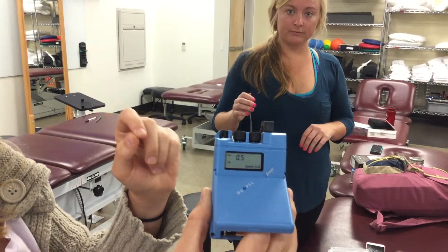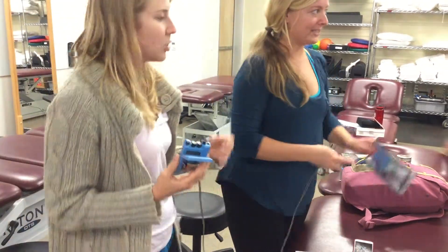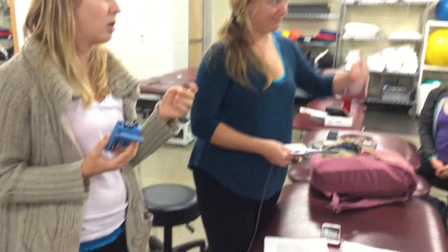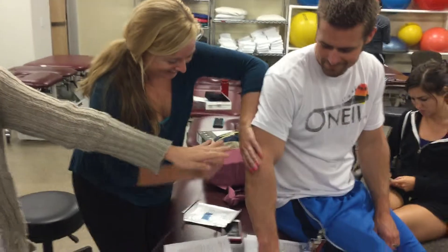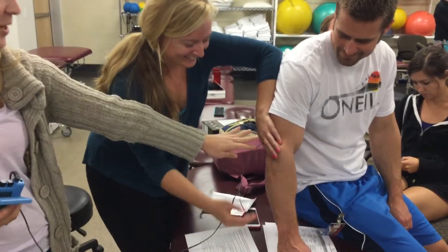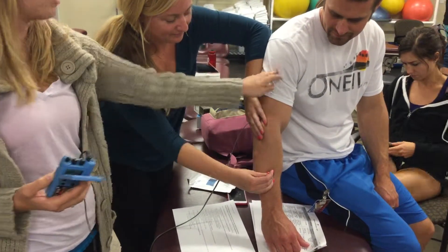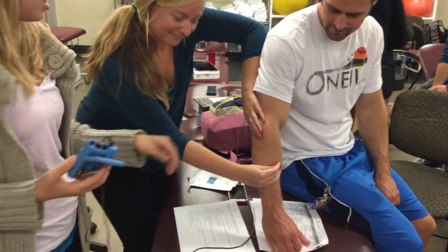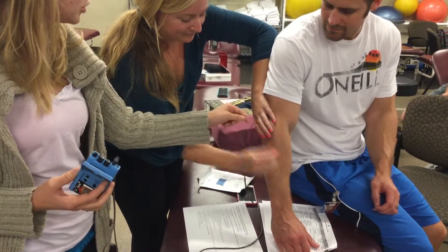Once you have the dosage set, you can place it on the patient. Put the pad directly on the blue pad where the medicine is, directly on to the site of the injury or the pain. The other pad can go either above or below the site of the pain.